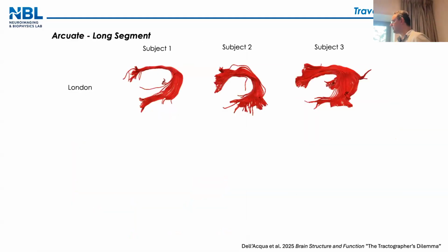And why is tractography so special? Because tractography is starting to show something new. It's starting to show, for example, that there is something across different subjects. When we do neuroimaging, we normally normalize voxels to MNI, this kind of stuff, but you see there is a lot of variability. This is an experiment we did many years ago across different sites, and we had some traveling heads going around scanning on different sites.